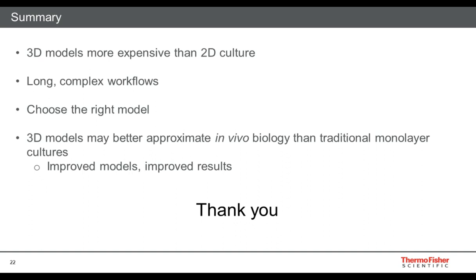How do you harvest or transfer spheroids from a 96 well U-bottom plate? The short answer is very carefully. So depending on how big your spheroid gets, it'd be pretty tedious to do this one well at a time, but some handheld things like disposable sterile transfer pipettes can be used to do that.